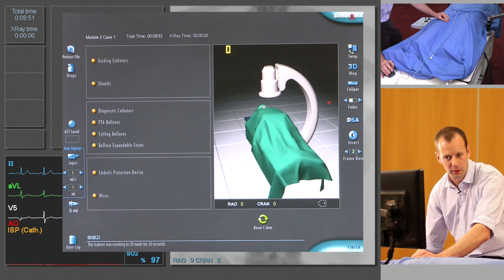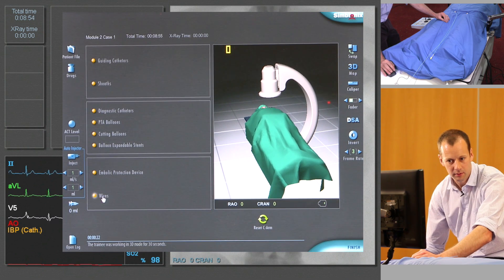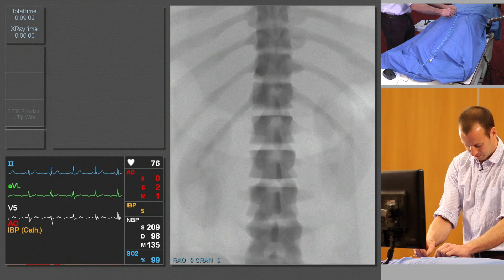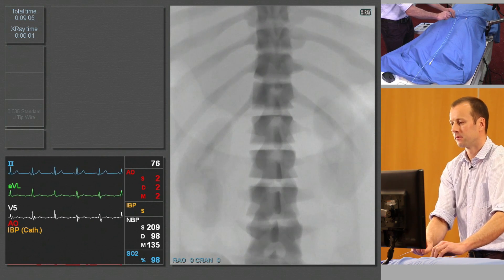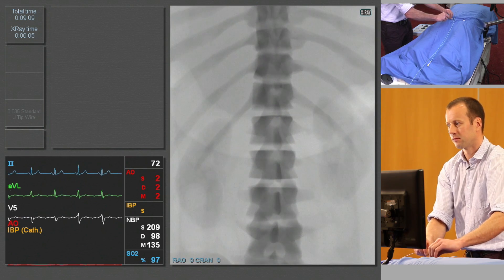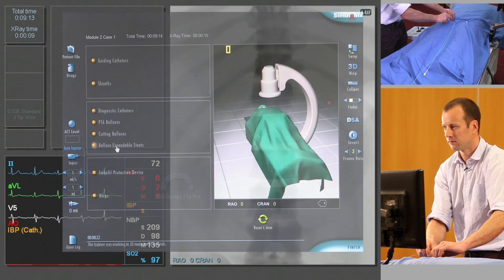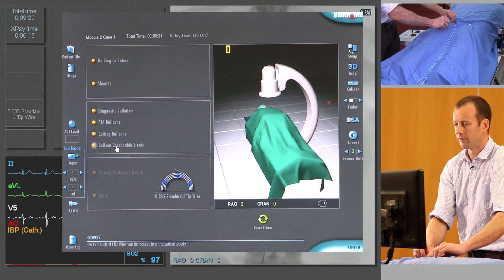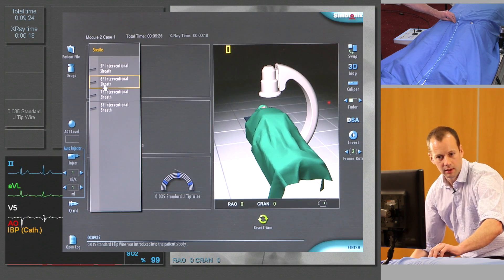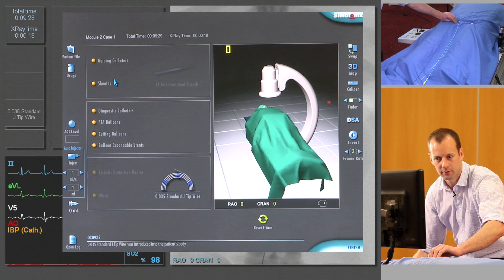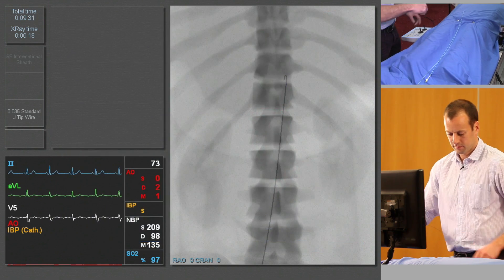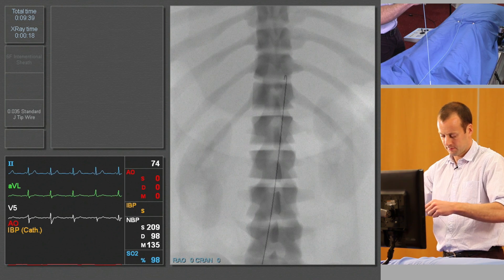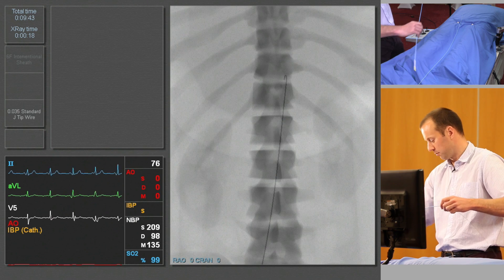We're going to start with a standard J-tipped guide wire and advance that into the abdominal aorta about to the level of the diaphragm, and then insert an access sheath. We've chosen a six French sheath because that's large enough to allow us to insert stents and balloons if needed.